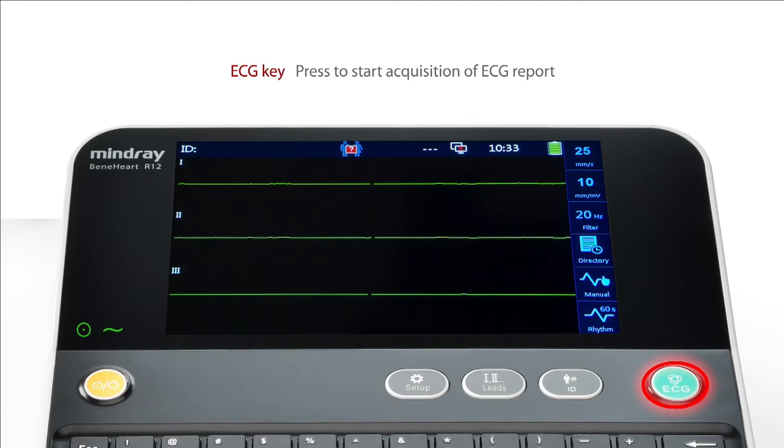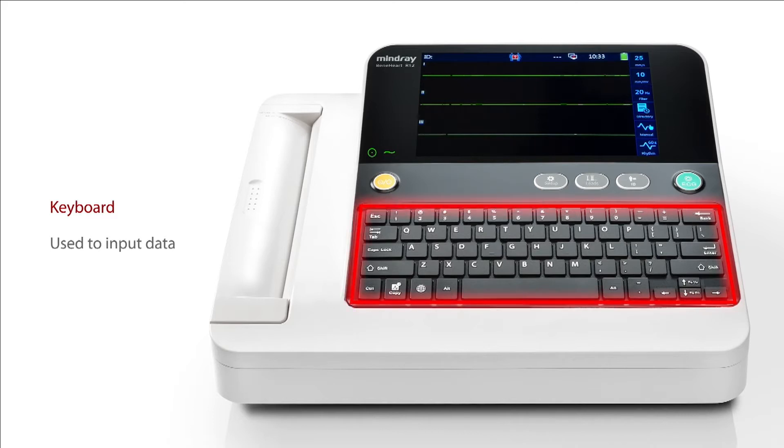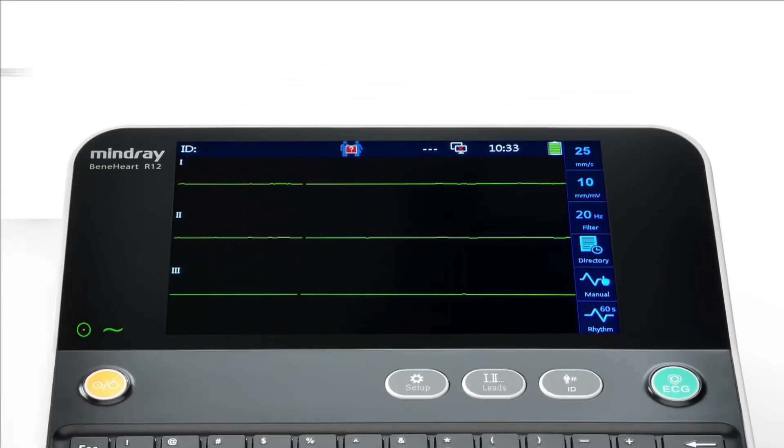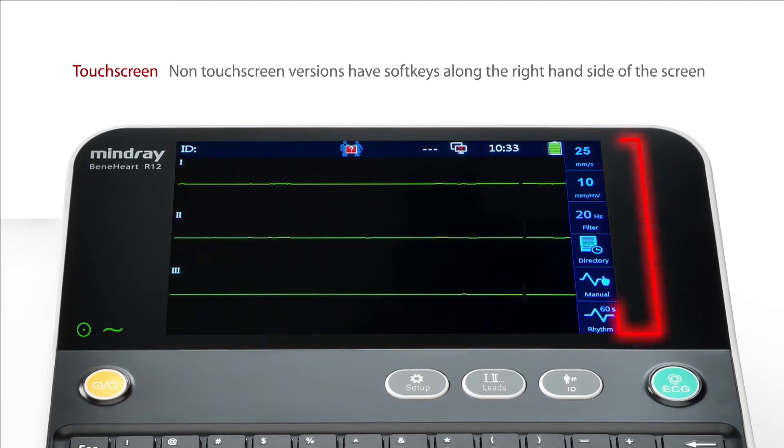This is explained in more detail in part 3 of this training series. The keyboard is used to input data. The device may have a touch screen. Non-touch screen versions of the R12 will instead have soft keys along the right-hand side of the screen.